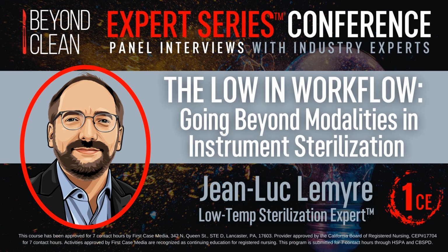Yeah, I think the information can come from both the instrument or the sterilizer manufacturer. So starting by first contacting a sales rep to try to get that information would work. From the sterilizer side, most sterilizer manufacturers put out their compatibility matrix that lists all of the devices they have validated, so it's easily accessible to the end user. Some instrument manufacturers also have some type of compatibility matrix that will supplement what's in the IFU as far as compatibility of diverse reprocessing methods for their device.